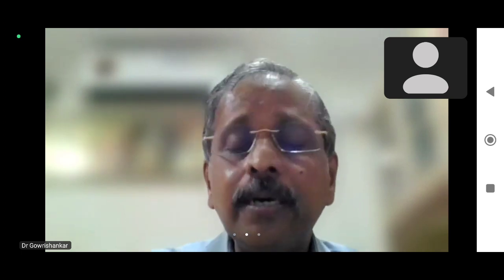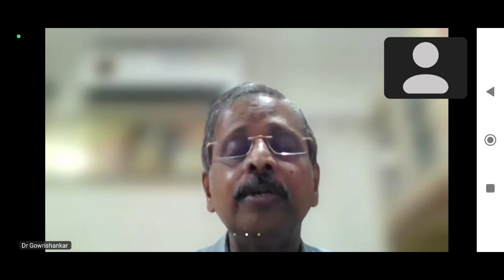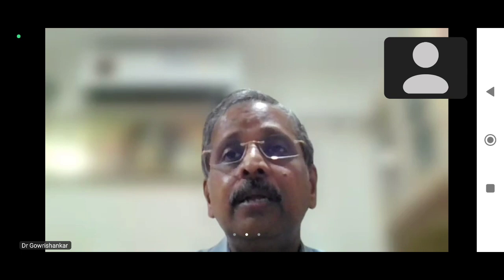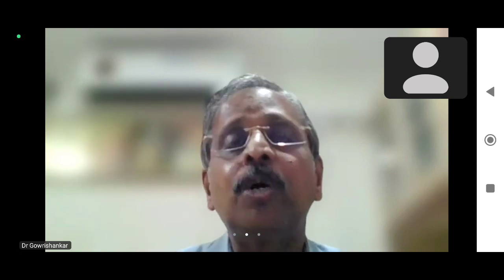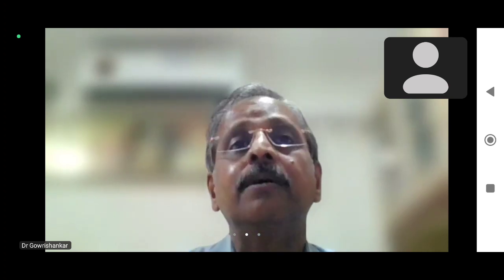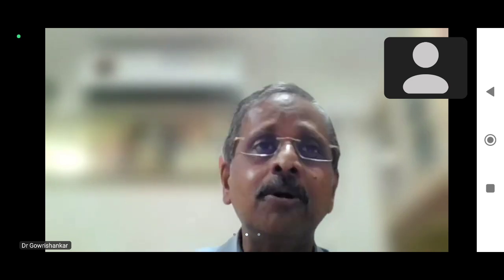For you to learn CT, you need to go to the CT console and look at the CT like a movie. What the patient brings is only the films, and the films do not reflect every part of the disease. Only when you look at it in the CT console do you know how much pathology is there.